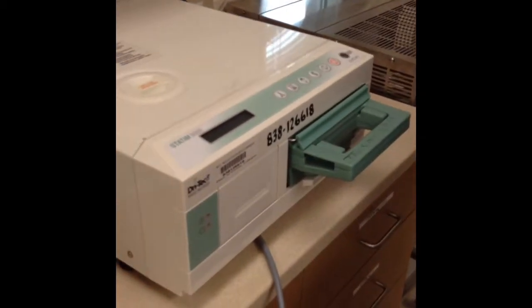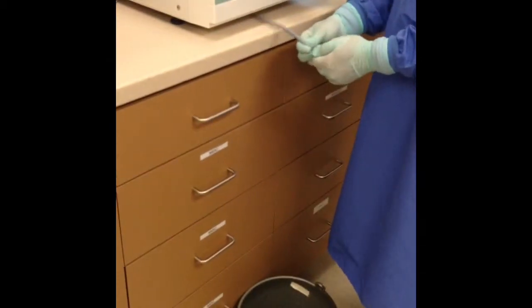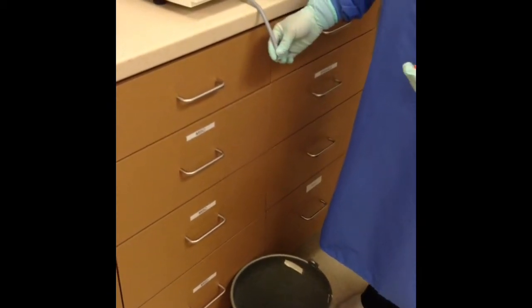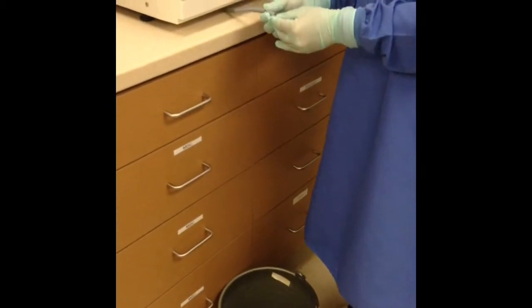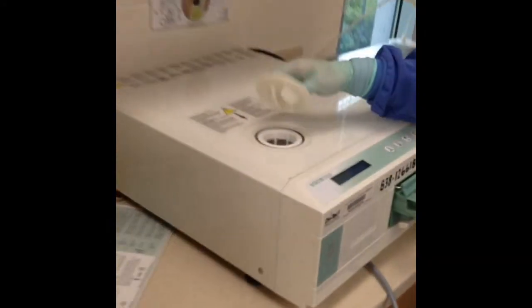You can empty the waste bottle if needed, using the tube — there is a little end piece that you click off. To add distilled water into the Statim, use the hole on top.